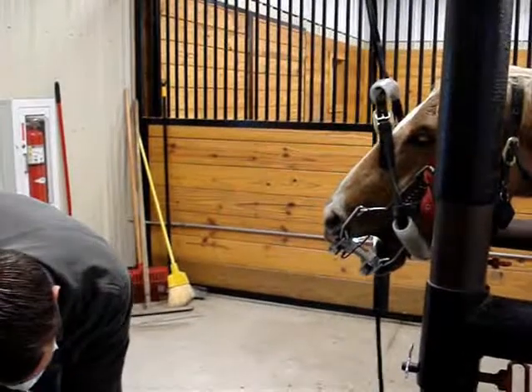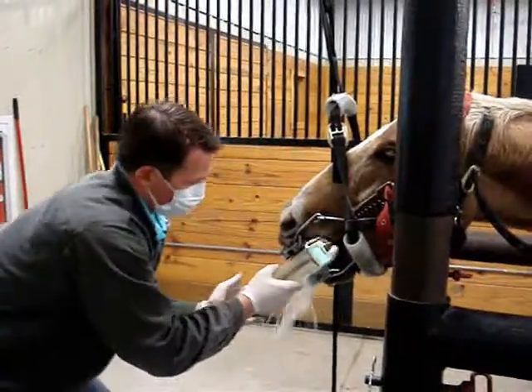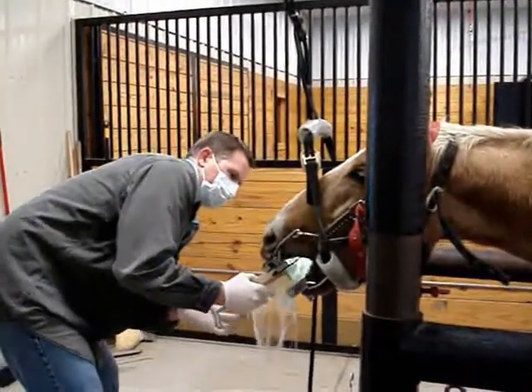We wash out the mouth with an antiseptic rinse prior to the procedure. This removes feed material, which is often packed into the chewing surfaces of the teeth. It is difficult to fully evaluate the mouth if there is any feed material remaining.